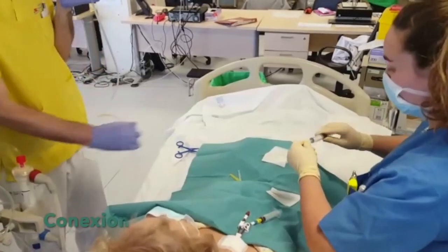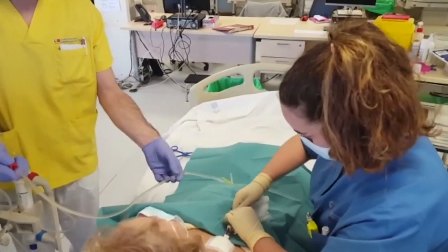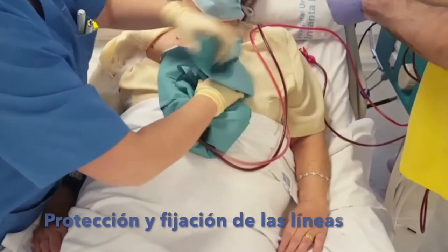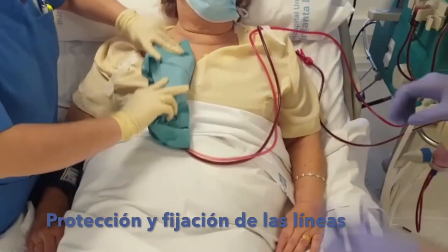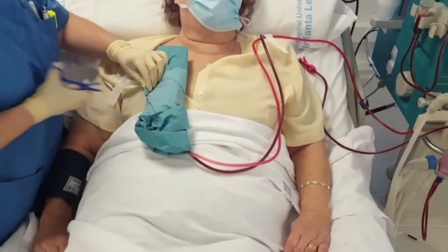The catheter is then connected with great care to avoid contamination. Finally, the catheter connections are protected with a sterile cloth and the lines are fixed to avoid pulling. Everything is ready to start the dialysis session.